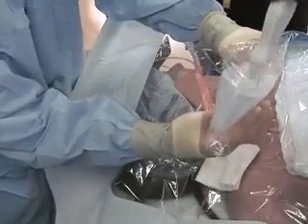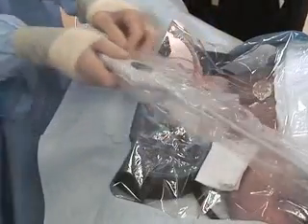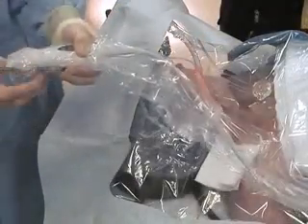If using ultrasound, prepare the ultrasound probe with a long sterile sleeve, being careful not to contaminate the sleeve prior to placing it on the sterile field.